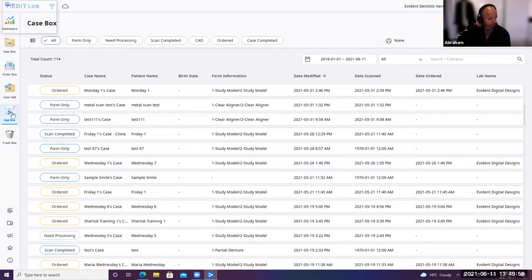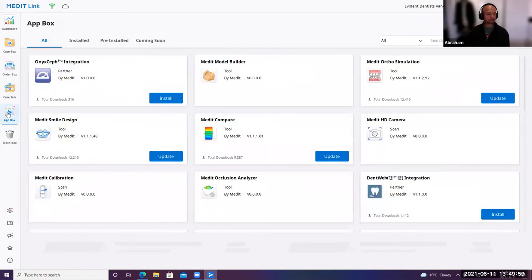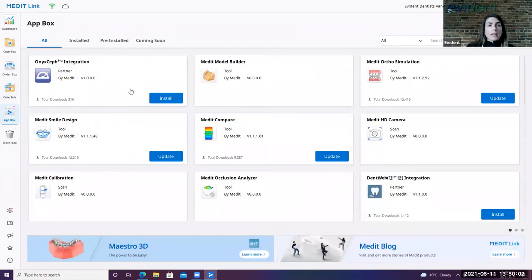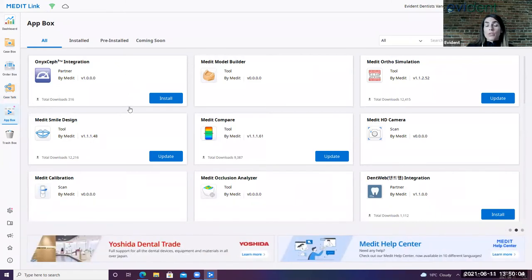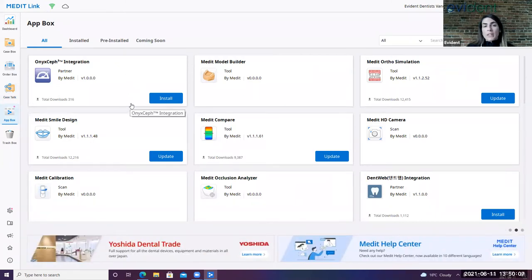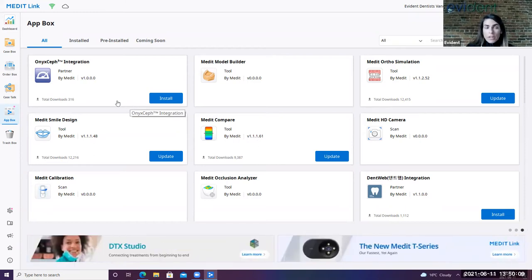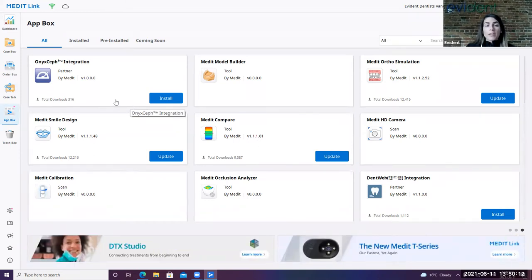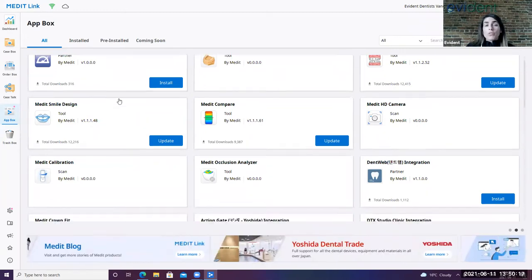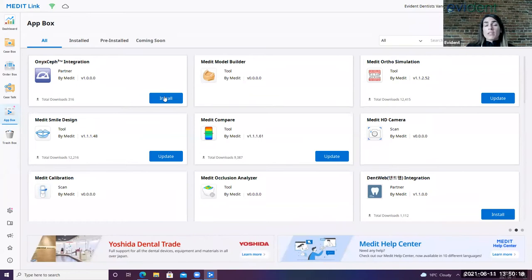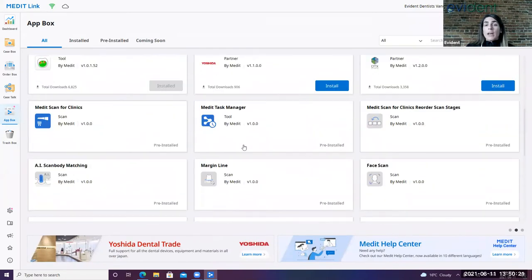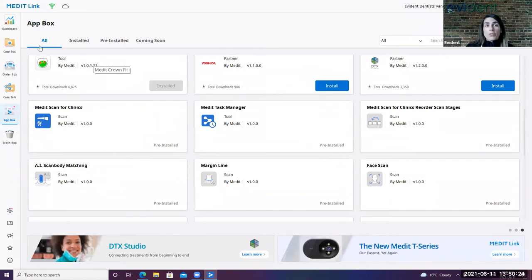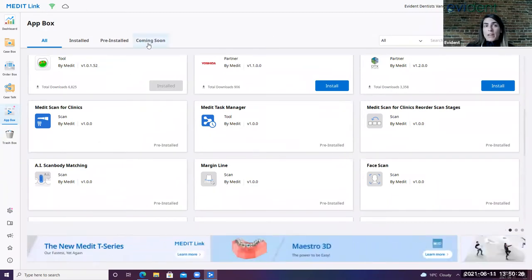The app box is kind of this last important section here on this first few steps. This is where you're going to go and receive your software updates. So with both the 700 and the 500, you've got really good hardware and Medit's done a really great job now to focus on what they can provide on the software side of it. So you'll see that there's constantly things that are available for install or for update. There's things that have been pre-installed with your scanner as well. So you can come into the app box to sort all of that.